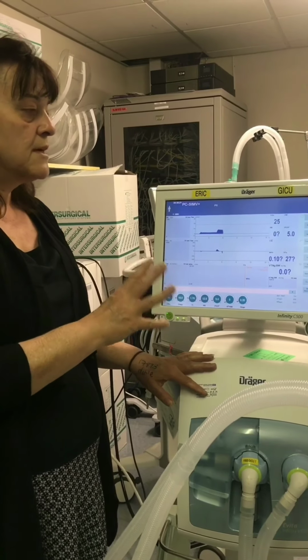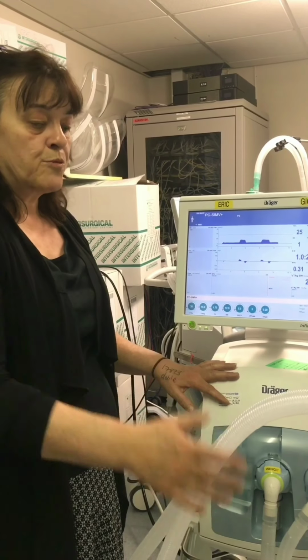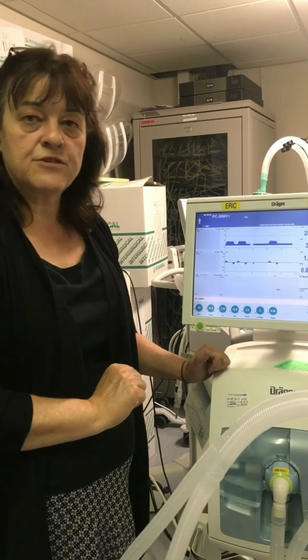Just one note, if a technician has set up the ventilator, then the pre-use check should have been done. It will probably have tubing on it or a note to say that it has been set up by a technician. So if you see those, then you don't have to do that pre-op check.